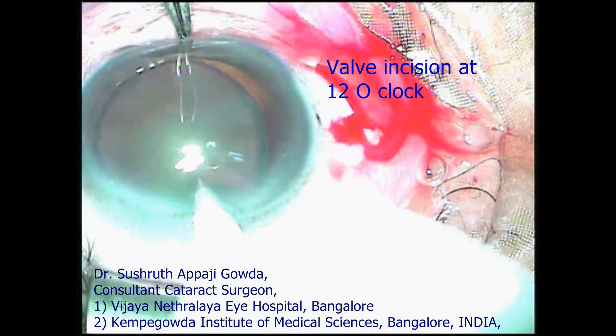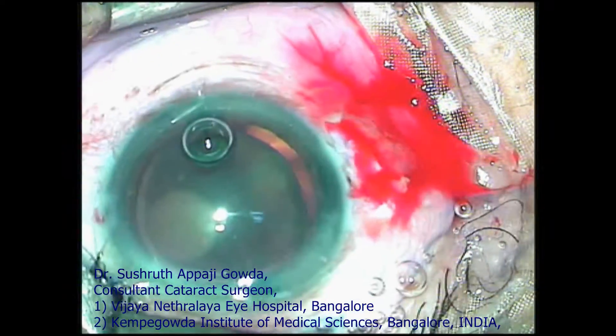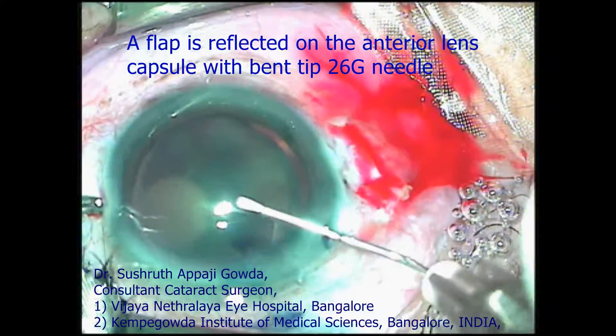You can see this is a subluxation from 6 to 11 o'clock meridian with surgeon based at 12 o'clock. Hoffman's pockets are made at 9 o'clock meridian.